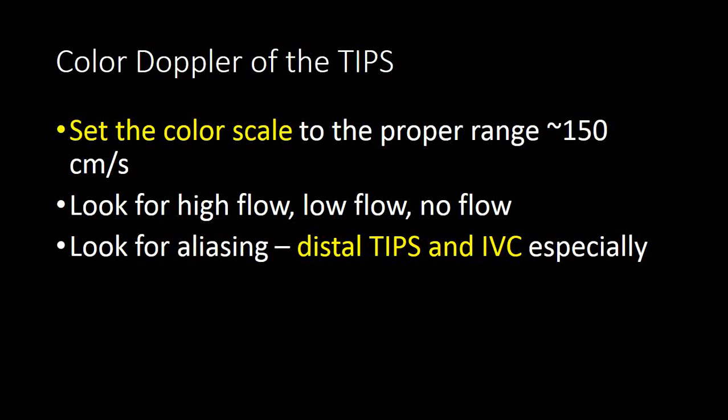So when we think about color Doppler of the TIPS, one of the first things I want you to think about is color scale. After we've looked at the portal vein, we're now moving on to evaluating the TIPS stent itself, and we're going to first do that with color Doppler.